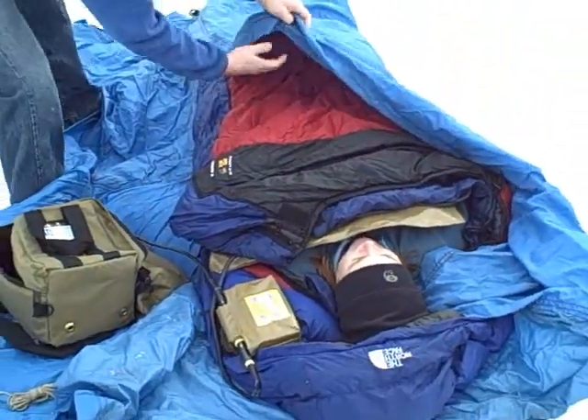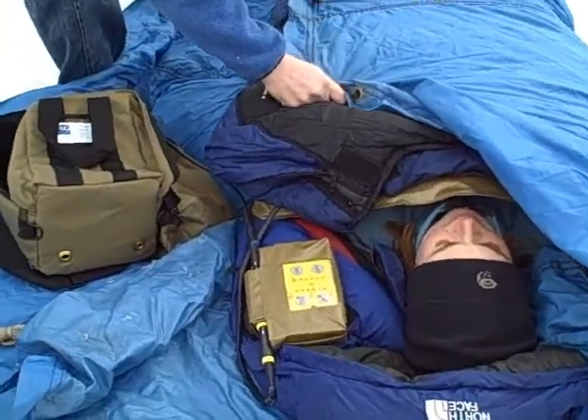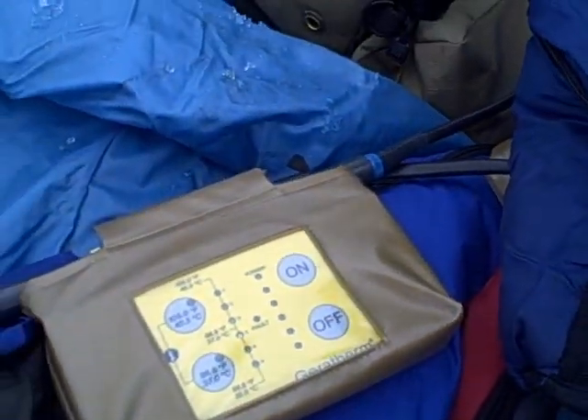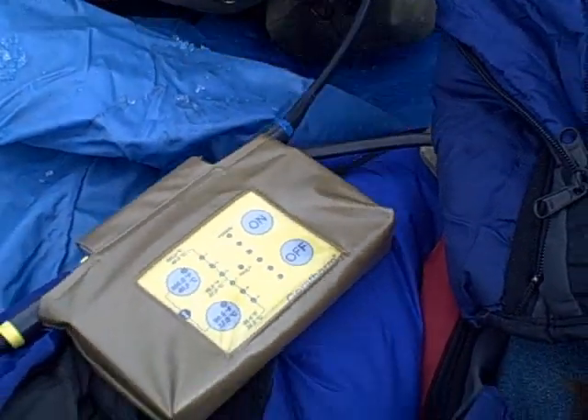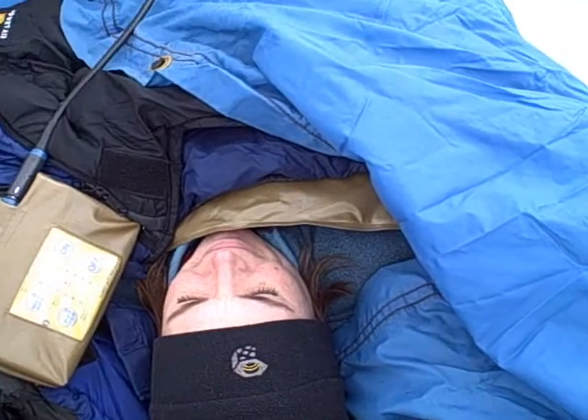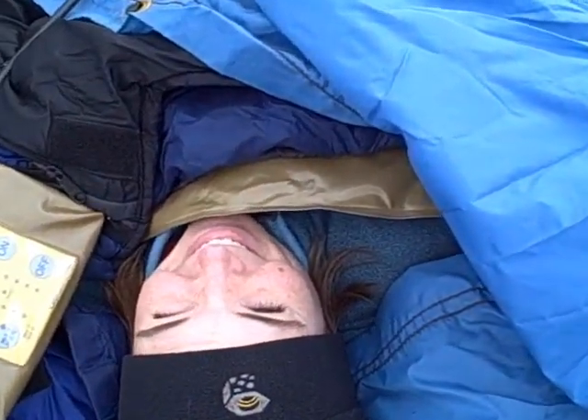Kevin's just buttoning her up again. Got the controller here. Shows that it's set at 105 Fahrenheit, which is 40.5 C. Amanda, can you feel a difference? Yeah, it's toasty.